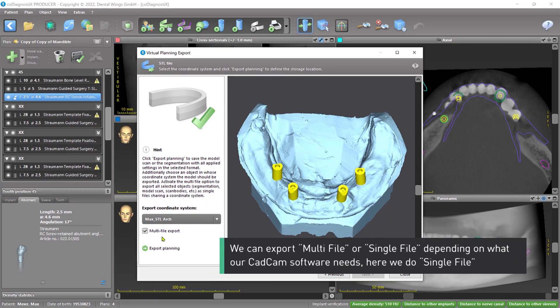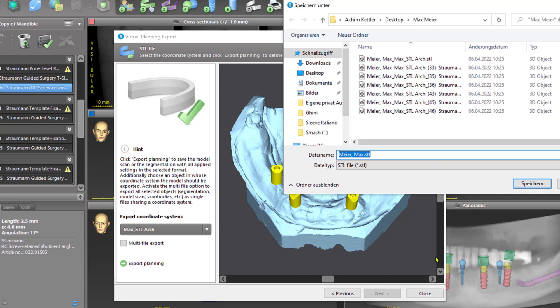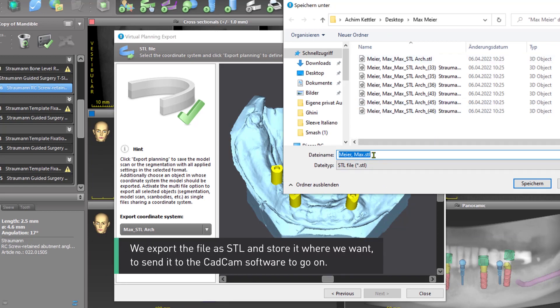We can export multi-file or single-file depending on what our CAD-CAM software needs. Here we do single-file. We export the file as STL and store it where we want to send it to the CAD-CAM software to proceed.